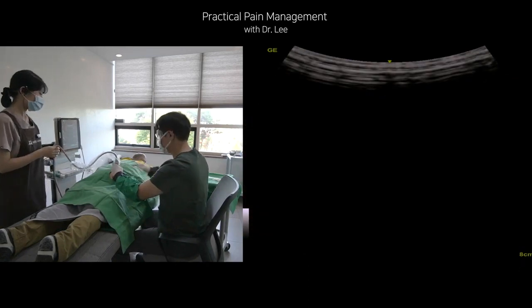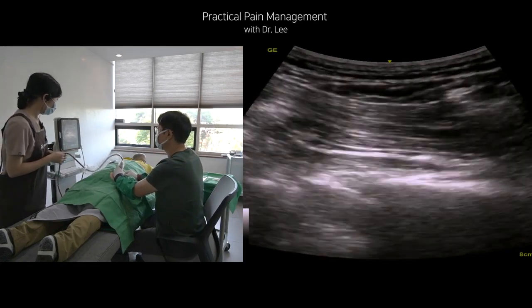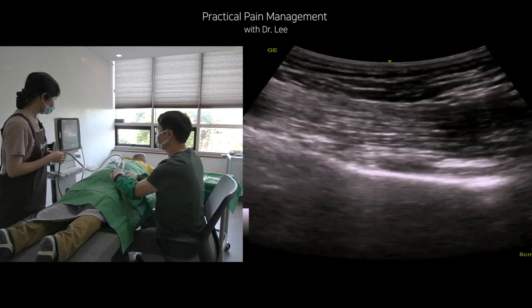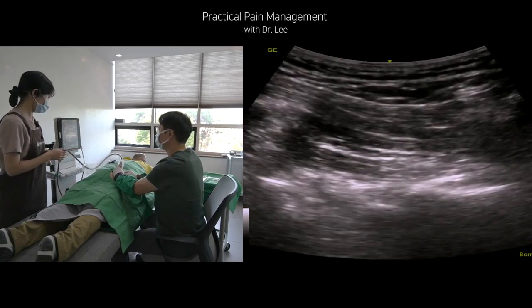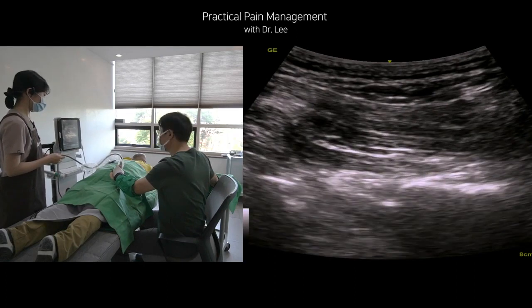The left side of the monitor image is the medial aspect of the body. First, I am scanning the piriformis muscle. Then, I am targeting the piriformis muscle and the interfascial layer between the piriformis and gluteus maximus muscle. I want to avoid unintentional sciatic nerve injury during the needle insertion, so I communicate with the patient continuously.